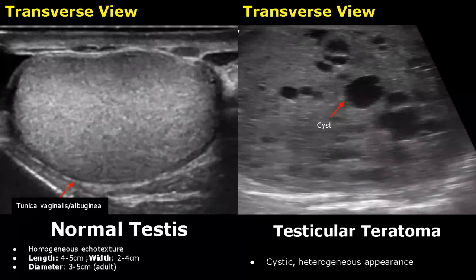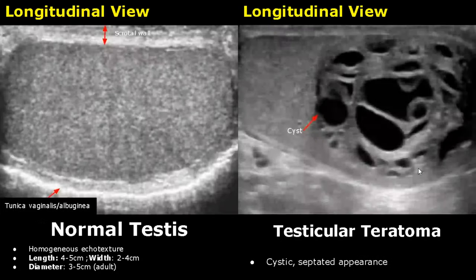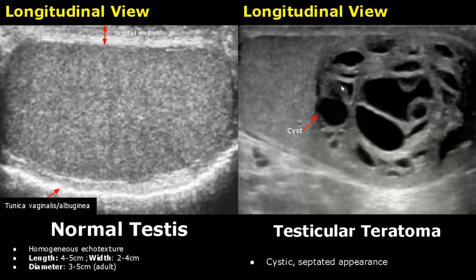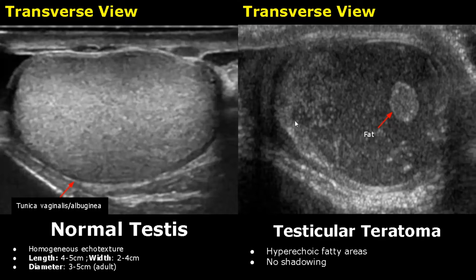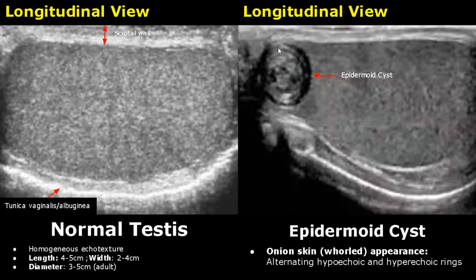Testicular teratoma is a mixed germ cell tumor. This tumor has a heterogeneous mass with cystic areas. Here is another image of teratoma — it has a cystic mass with multiple septations. A testicular teratoma can also have hyperechoic fatty areas with no posterior shadowing, and can have variable appearances overall.